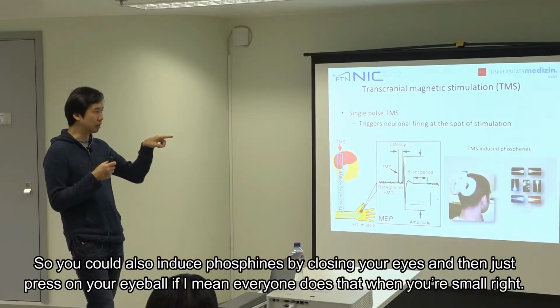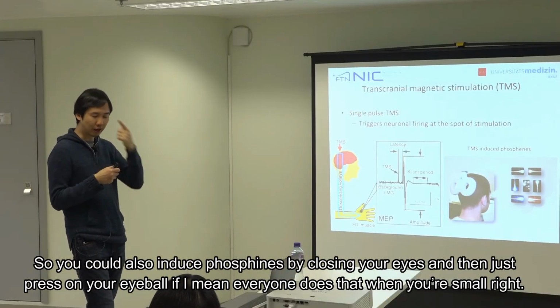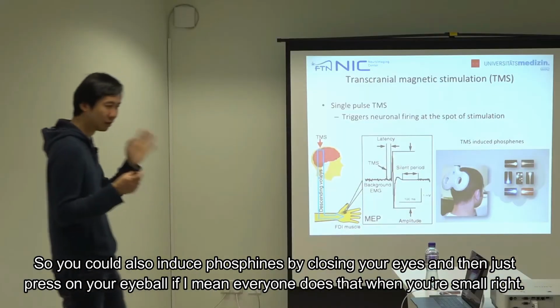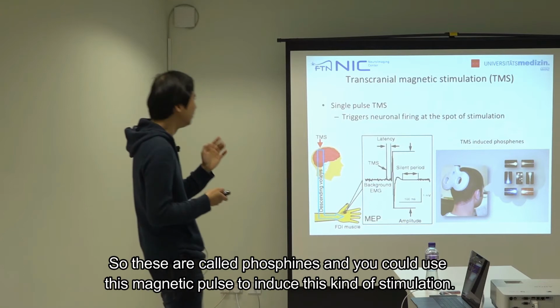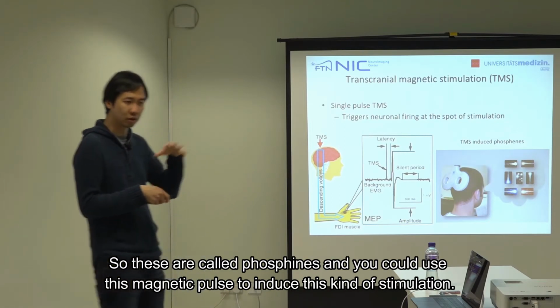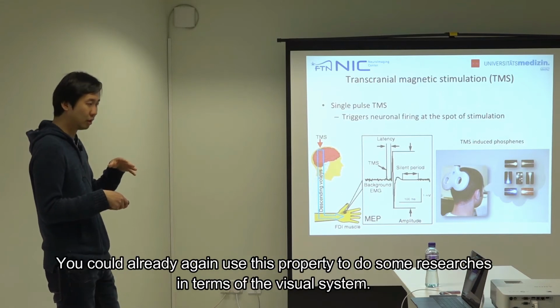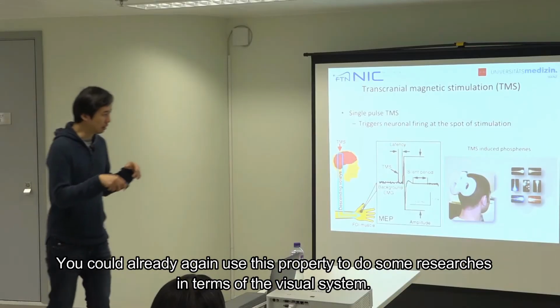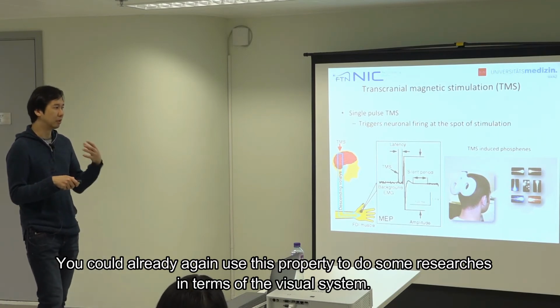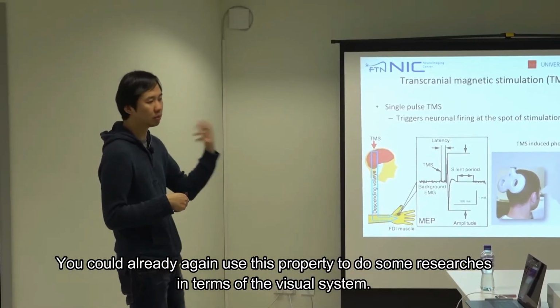You could also induce phosphenes by closing your eye and then just pressing on your eyeball. Everyone does that when you're small, right? So these are called phosphenes. And you could use this magnetic pulse to induce this kind of stimulation. You could already, again, use this property to do some research in terms of the visual system.